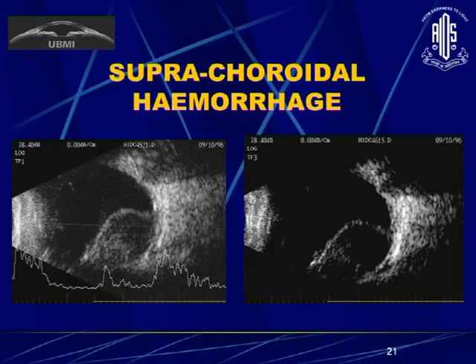Again, the same, sometimes in suprachoroidal hemorrhages, the choroidal membrane may not be highlighted very well. You need to amplify and use the machine very well to highlight the choroidal membrane, and so this is suprachoroidal hemorrhage and not a choroidal mass lesion.